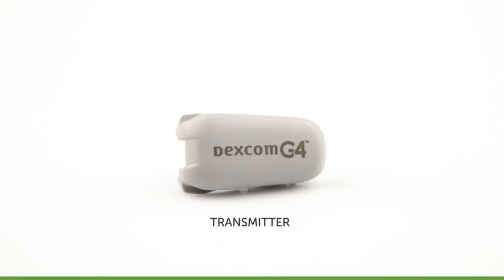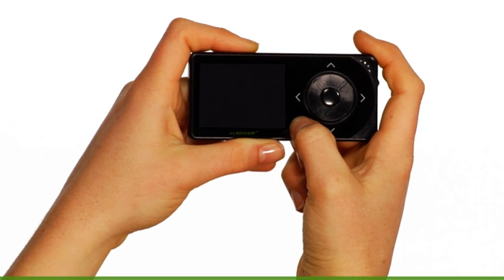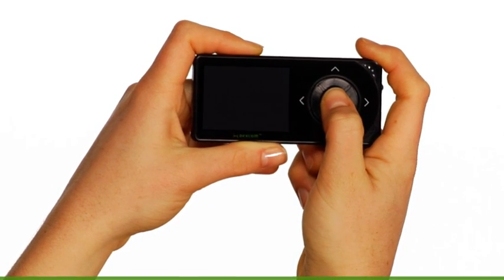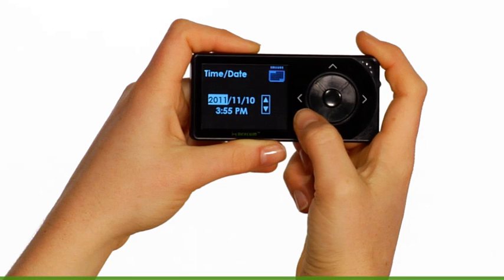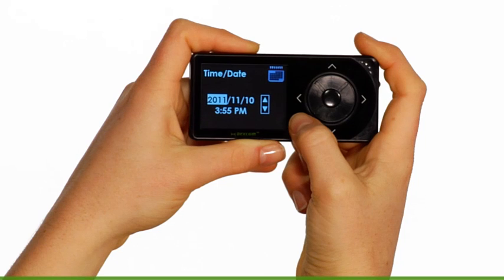Before setting up your receiver, remove your transmitter from its tray and wait 10 minutes for it to be activated. The first thing you're going to need to do is turn your receiver on. You do this by pressing the Select button. When you turn your receiver on for the first time, the device's setup wizard will help you get started by prompting you to enter the following information.